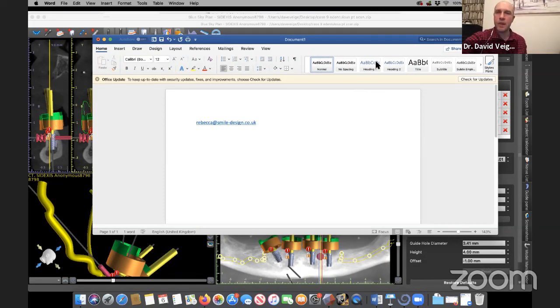Okay. I think I answered the question on what type of materials I've used already. My thinking on cantilevers: my preference is, if I can, to have vertical implants. If I can't, I guess the first question is, how many teeth are you restoring?